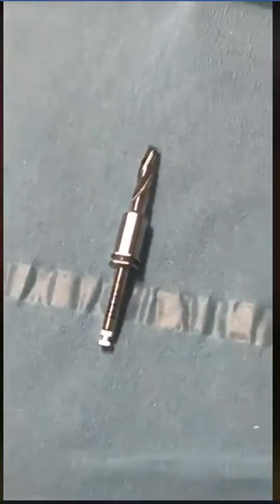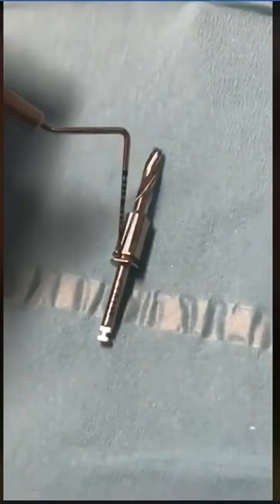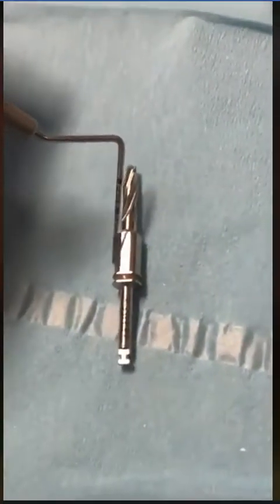What does that mean, a fully keyless? Okay, a fully keyless means that this burr has a stopper at this point in this area.